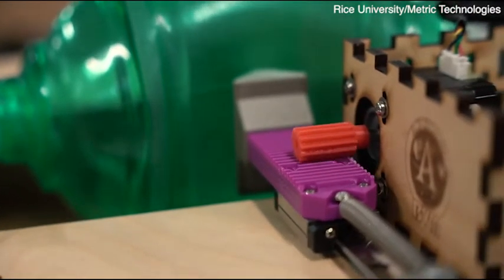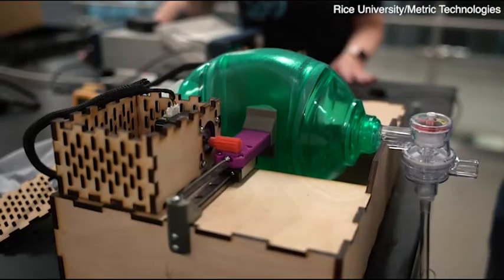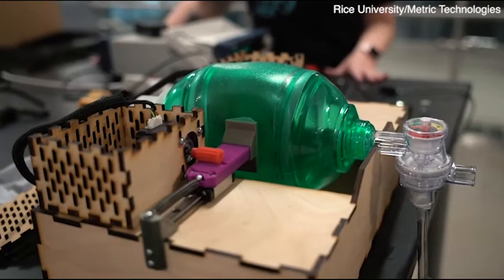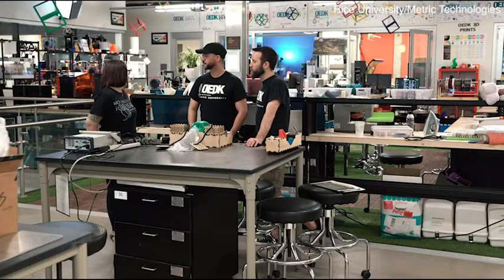Every kind of ventilator right now is in short supply just due to the needs of severe coronavirus patients. And so from my perspective as a robotics guy, it's just a robot that squeezes something. So it's super controllable. If we build it correctly, we can have really good control and fidelity of how we actually provide air to somebody. Similar to a real ventilator, not quite the same. Those things cost like 10 grand. The idea is roughly the same. We kind of apply pressure through someone's airway, but we're using off-the-shelf components.